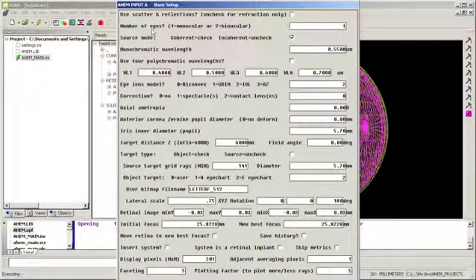So here I've got some settings. Going to use setting number 2 for intraocular lens for my eye model. So here's my number 2. And most of the other geometry is set up similar to the default mode. I'm using a source target. It's unchecked, filling the pupil. And so I click OK.